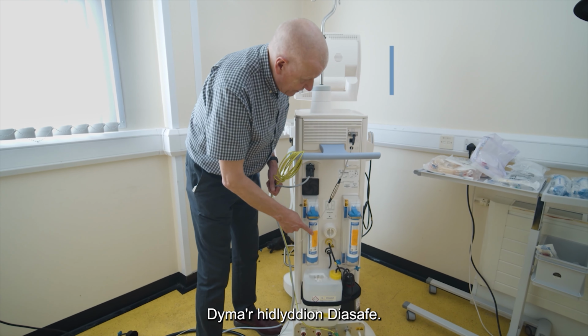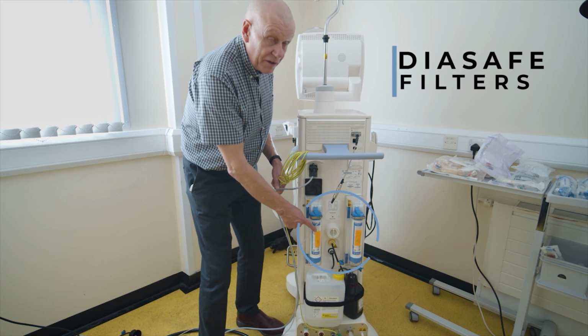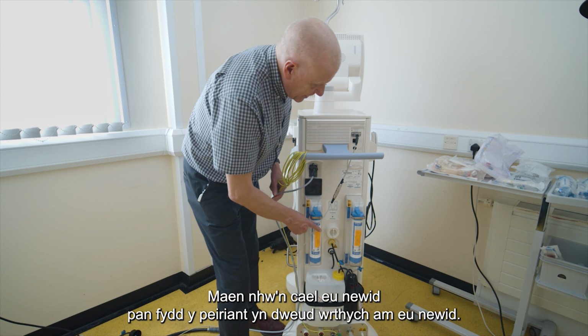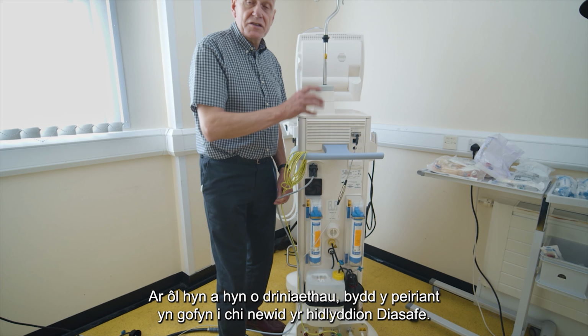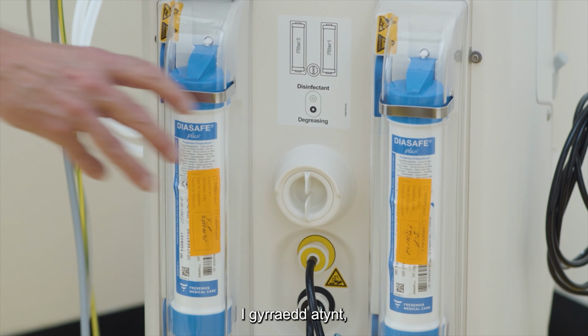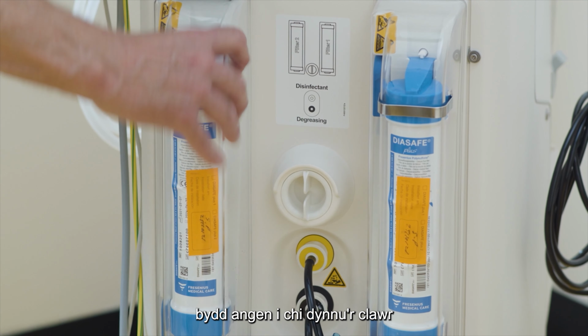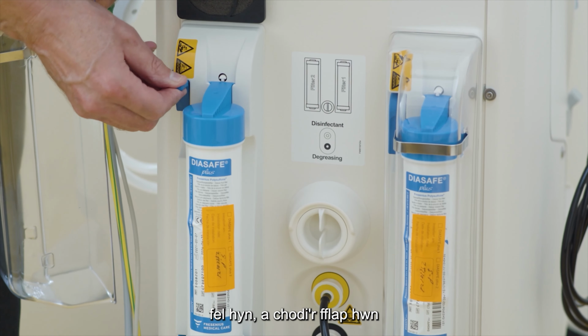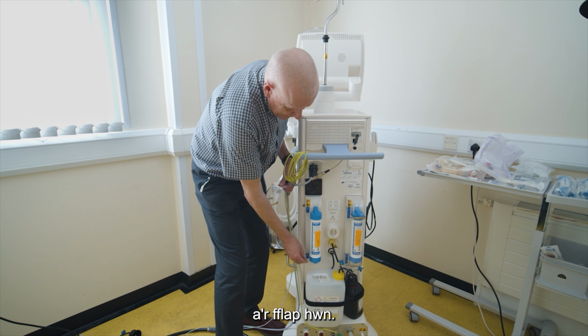These are the diasafe filters. You will be shown how to change these. They're changed when the machine tells you to change them. After so many treatments, the machine will ask you to change the diasafe filters. To get access to them, you take the cover off like that, and you lift that flap there, and lift that flap there.